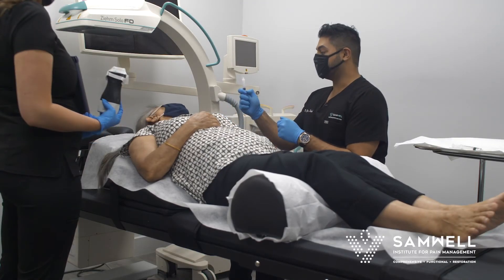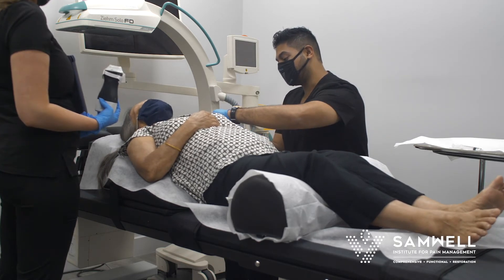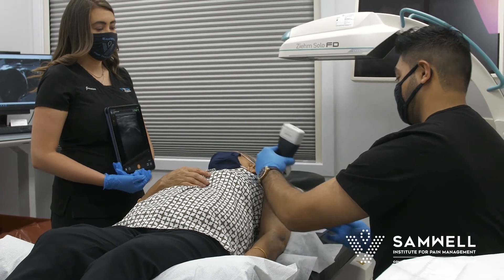Typically we use some anti-inflammatory medication as well as some long-term anesthetic. And that's it — we're all finished.